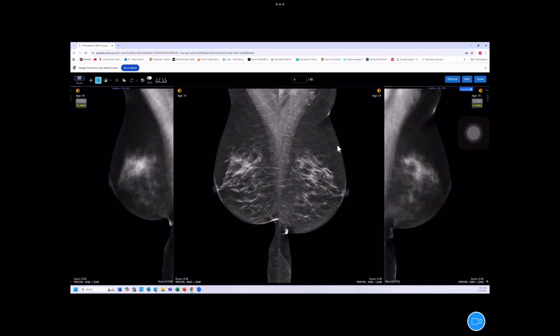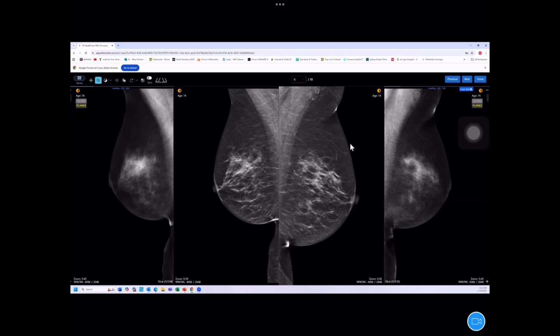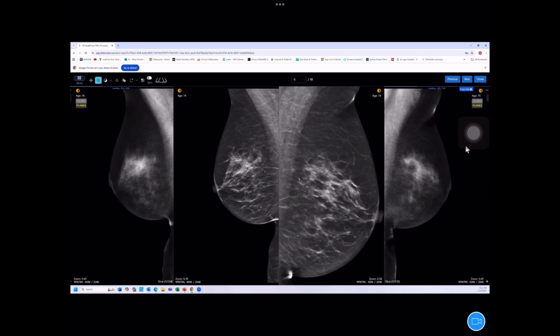Let's have a look at the other projection. So we might swap over to planes here, because this is a more difficult projection, isn't it? So let's zoom this image up, and I'll zoom this image up in a second when it's fully loaded.